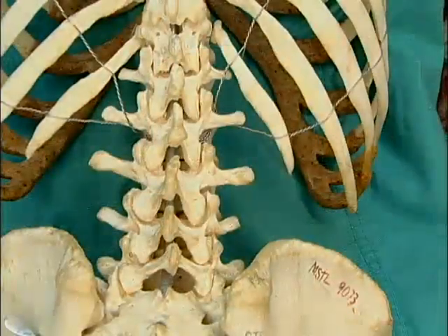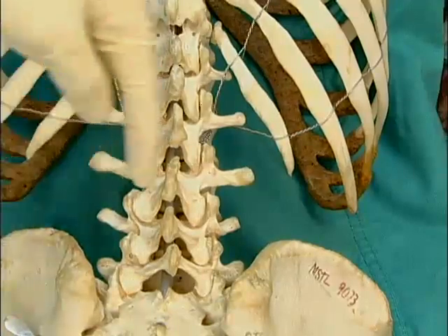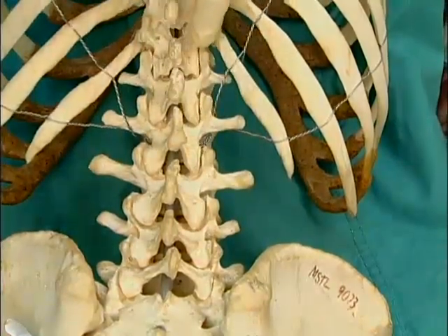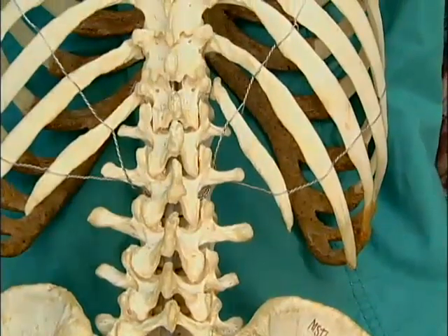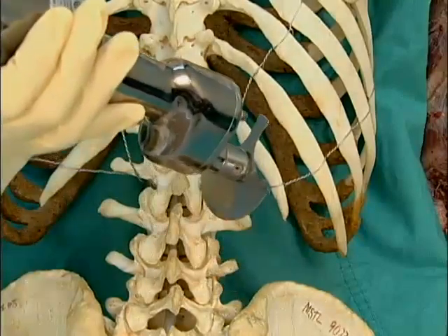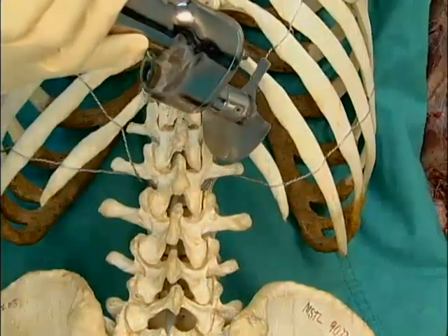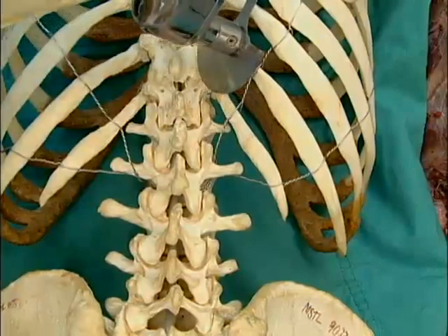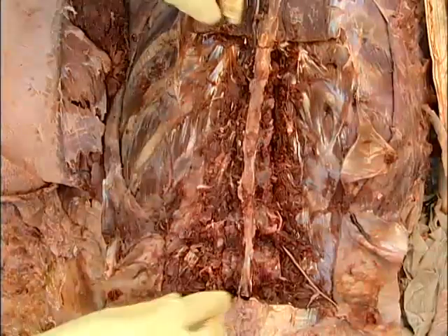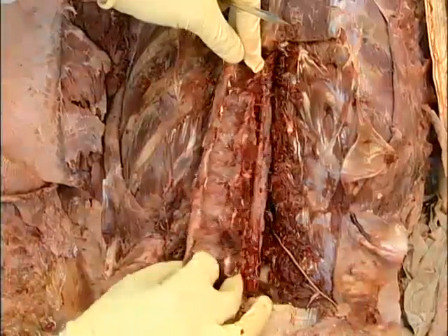The key to a successful laminectomy is to make the cuts as far lateral as possible and at a 30 to 40 degree angle. With the laminectomy completed, remove the spinous processes and the laminae from T8 to L4 as one unit.